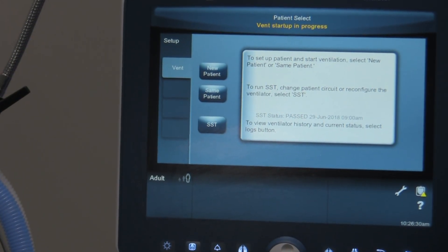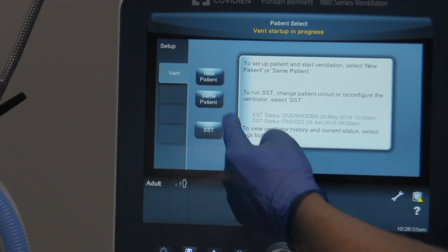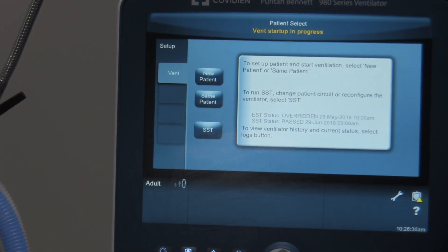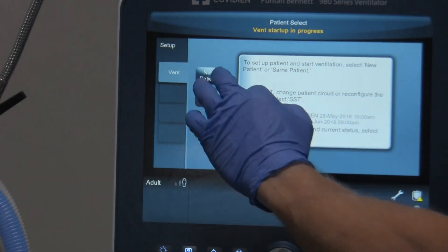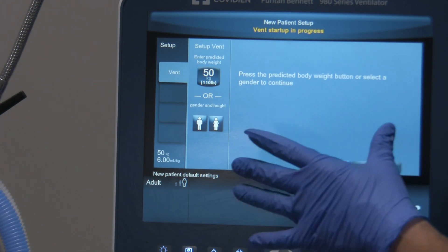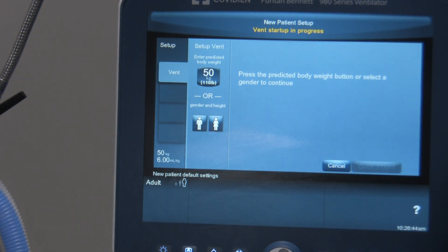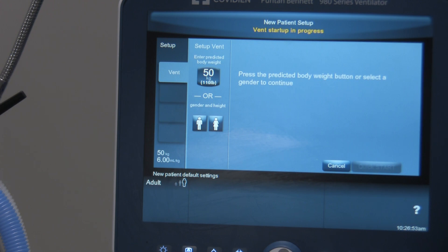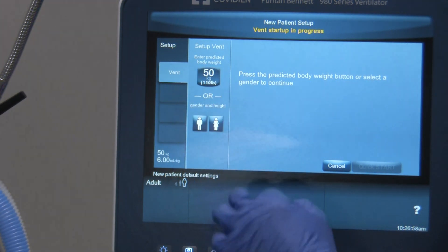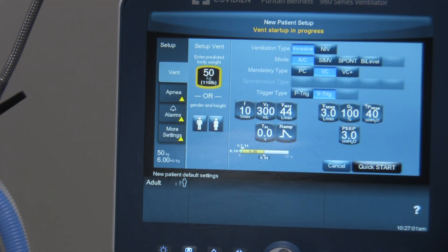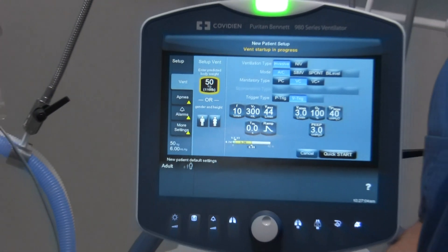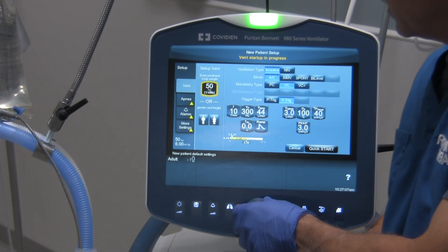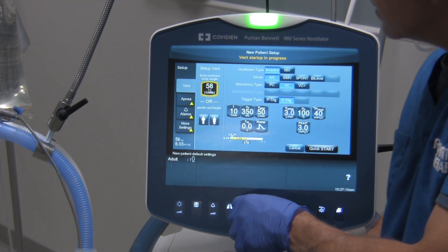On the ventilator, when you come to this tab, it's going to say new patient, same patient, or SST. We've already performed the SST, so we're going to select new patient. When you select new patient, it allows you to either program in the ideal body weight of the patient or select the gender. I'm going to choose the ideal body weight and adjust that to 60, using this rotary knob right over here.